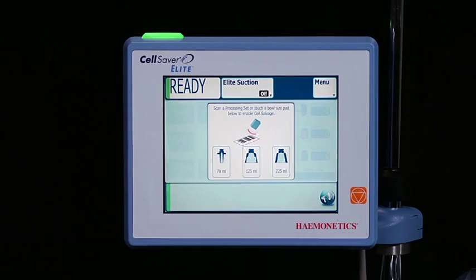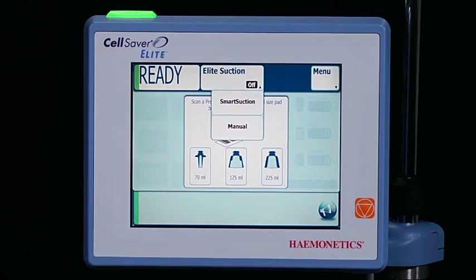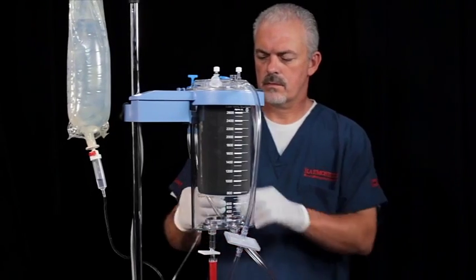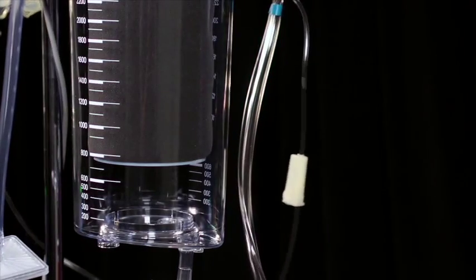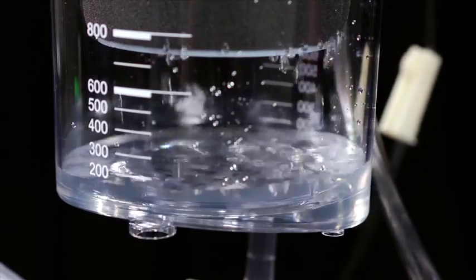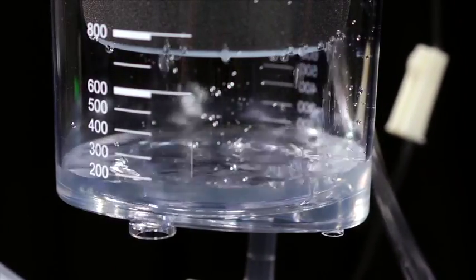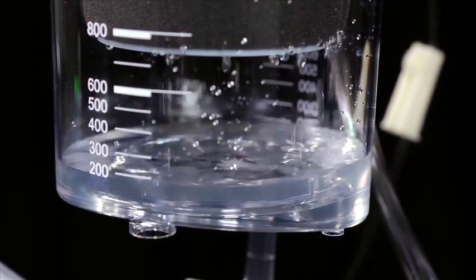When initialization is complete, the bowl selection screen will appear. Touching the Elite suction button will allow the user to select and turn on the vacuum type desired. Ensure that the roller clamp is open. The reservoir should now be primed until there is breakthrough of anticoagulant, approximately 150 milliliters. The device can now be used for a collect first procedure.